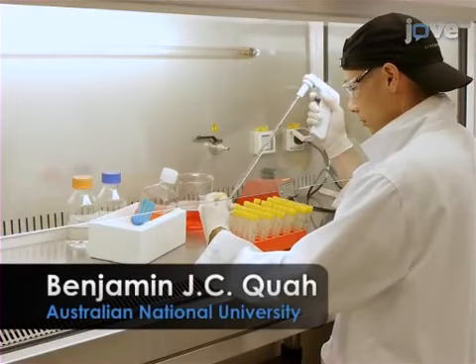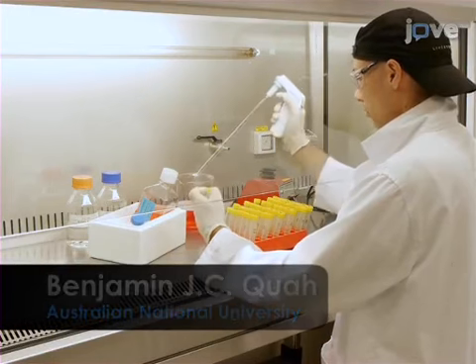Well, the major advantage of this technique over conventional in vivo CTL assays is that it allows a simultaneous measurement of over 250 target cells in one animal. Demonstrating the procedure will be Ben Quah, a research fellow in my laboratory.